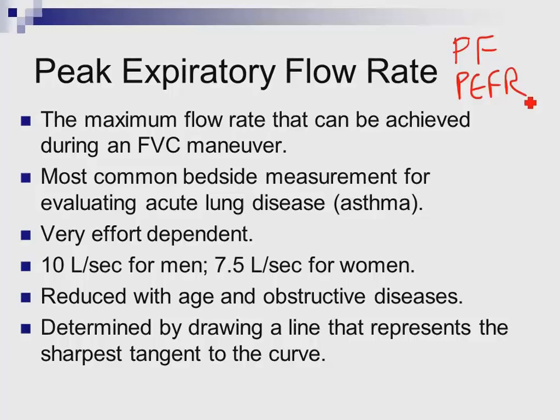This is actually one of the ones that we have the patients monitor at home, because it's easy for them to do. A simple device called a peak flow meter, basically just a reusable, I don't know how else I want to describe it. It's a little monitor that has some moving parts, obviously, but you can very easily monitor your asthma at home, and we'll talk more about that when we talk about asthma management.